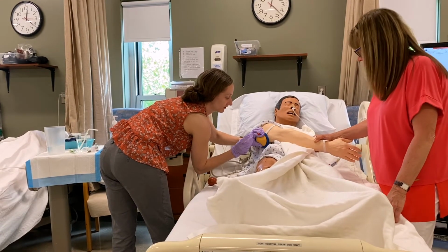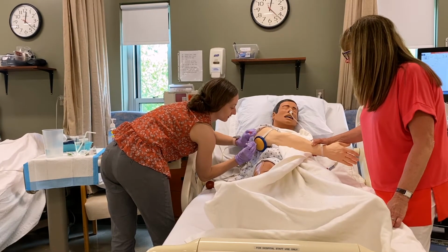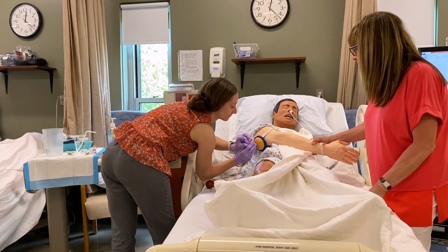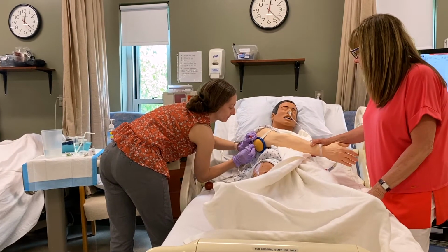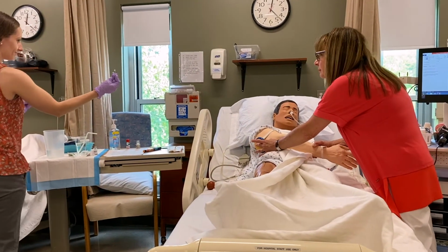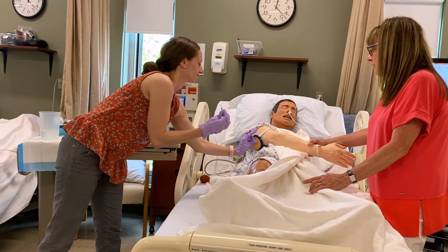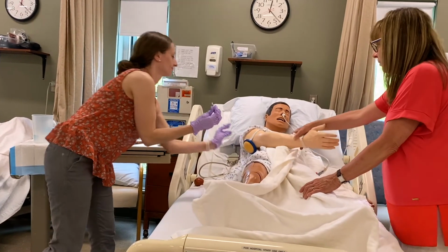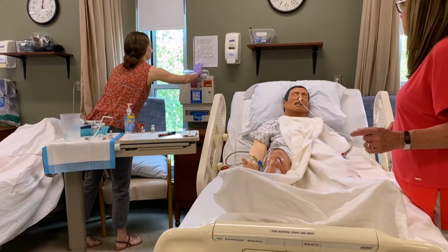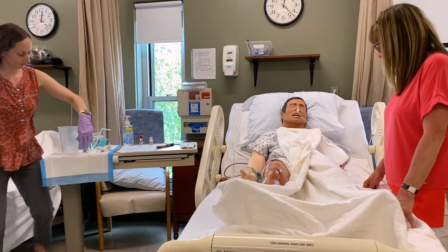I'm going to pinch. Okay, pinch. Straight in. Good. Two-handed technique, holding the syringe and then pushing in the contents. Good, very good. And she's going to put the alcohol over the site, just make sure that it stays in. Great, good. One hand behind your back, very good. There we go.